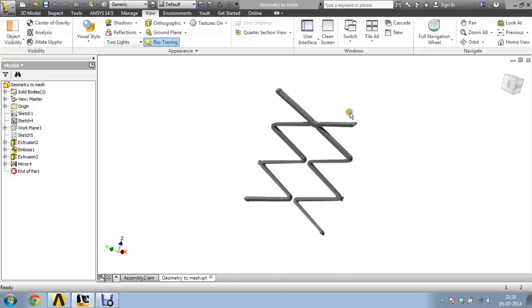So this is typically a one cell component. So this one is a one cell and this is mirrored into this, so it forms 1/24th part of the whole stent. So it is an axisymmetric model and it has been ray traced here now, so you can see it very clearly, like a real looking stent kind of structure.